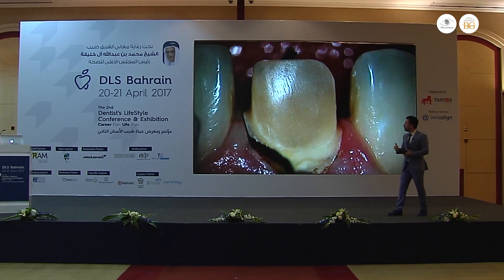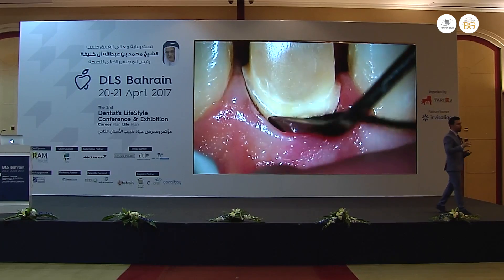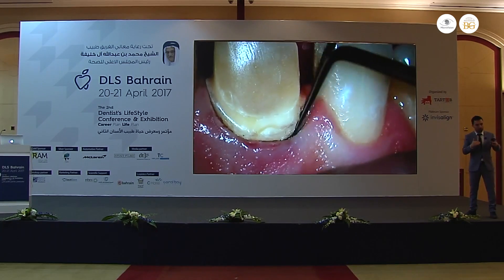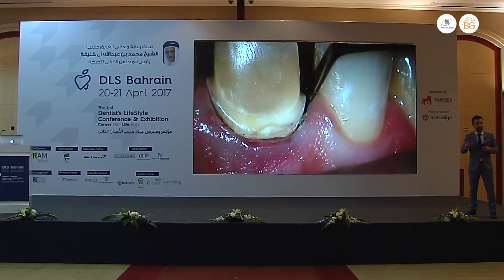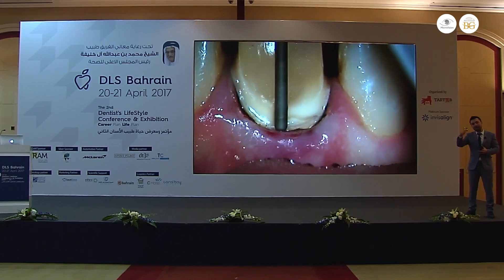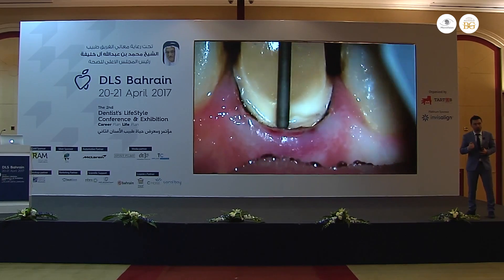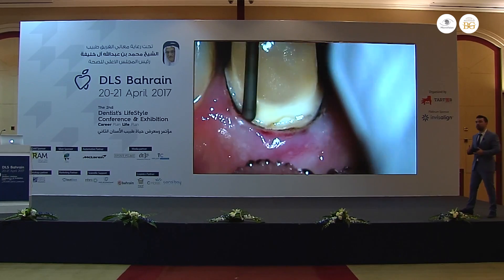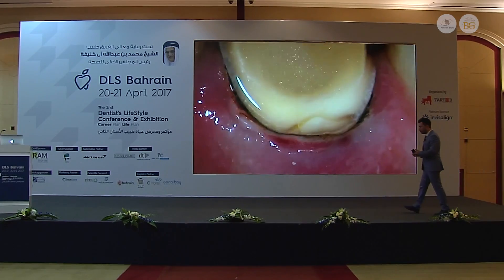In this case, we made some soft tissue adjustments because the position of the gingiva was different in the two adjacent centrals. That's why we removed the rubber dam, then I made some electrosurgery, I placed retraction cord, and I finished my preparation without the rubber dam.